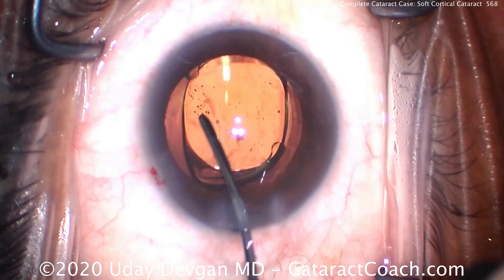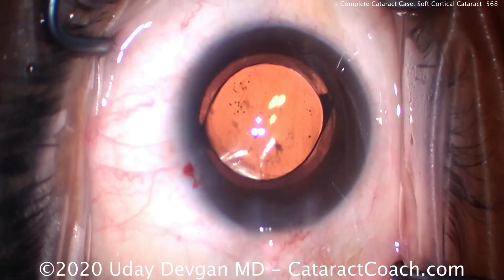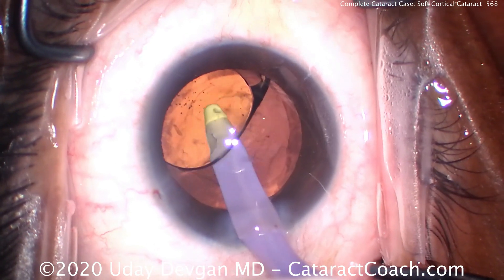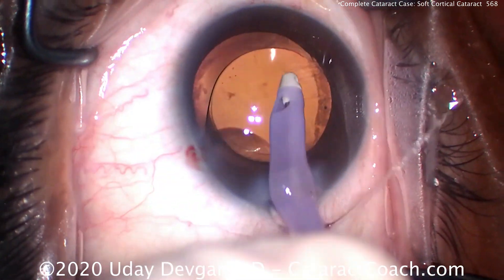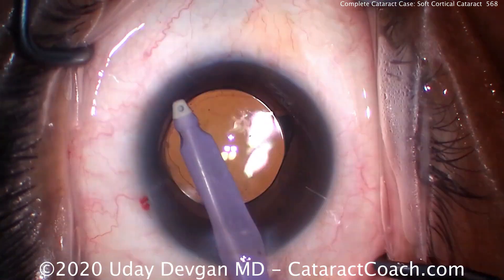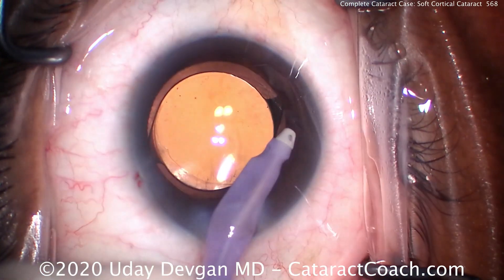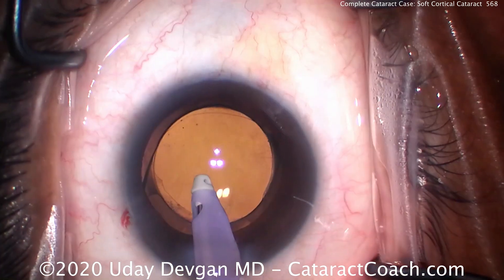Third: get the nucleus out of the capsular bag. We know it's a soft lens with minimal density — let's get it out of the bag to facilitate surgery. Number four: use the chopper in the safety position to prevent any problems. In a young patient, you definitely want to place the lens in the capsular bag. This patient is 50 years old — what we do in his eye, he's going to look through for at least 30, maybe 40 or 50 more years. So we want to do a job that's great and stable for the long term.